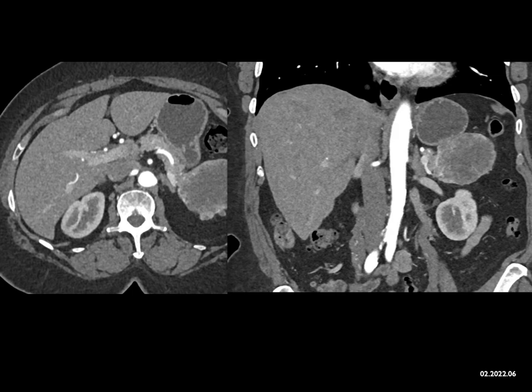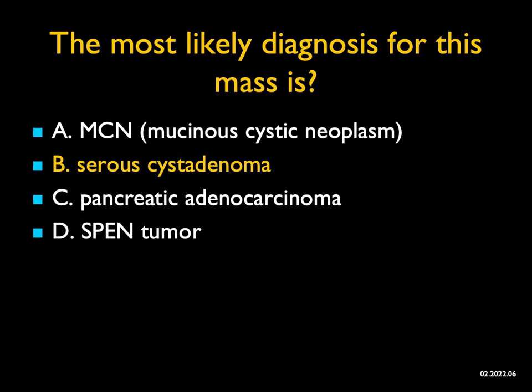And in this case, I would say this patient is going to have this resected because I'm really just too concerned with dealing with a mucinous cystic neoplasm. And because of the wall thickening, I would worry about high-grade dysplasia. But at surgery, this was a serous cystadenoma. Just one of the challenges with serous cystadenomas, which often are so classic, but not that uncommonly are really difficult diagnoses.